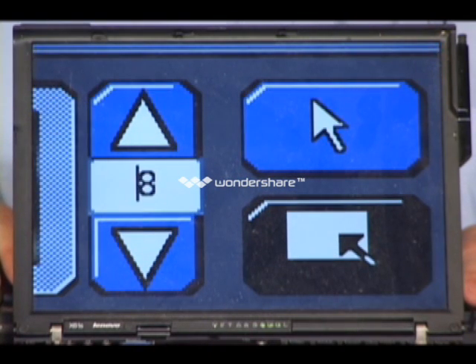Now, how big? What do you see there now? The 8. Some of the symbols. Okay, this is 8 times. That's getting pretty large on most computer screens, unless you've got a large screen, 22-inch or 30-inch or something. This is going to take a lot of real estate. If you really have to have it this large, you may start wanting to look at some other access, maybe JAWS or something else to help you with that.